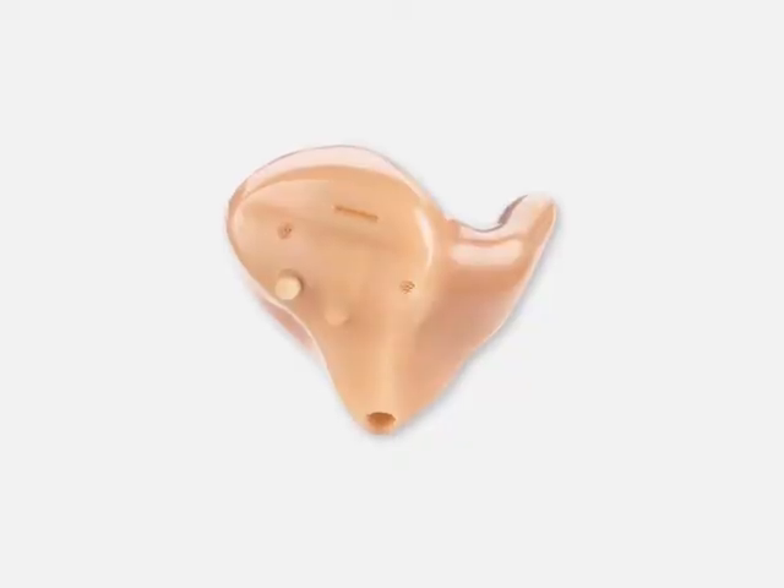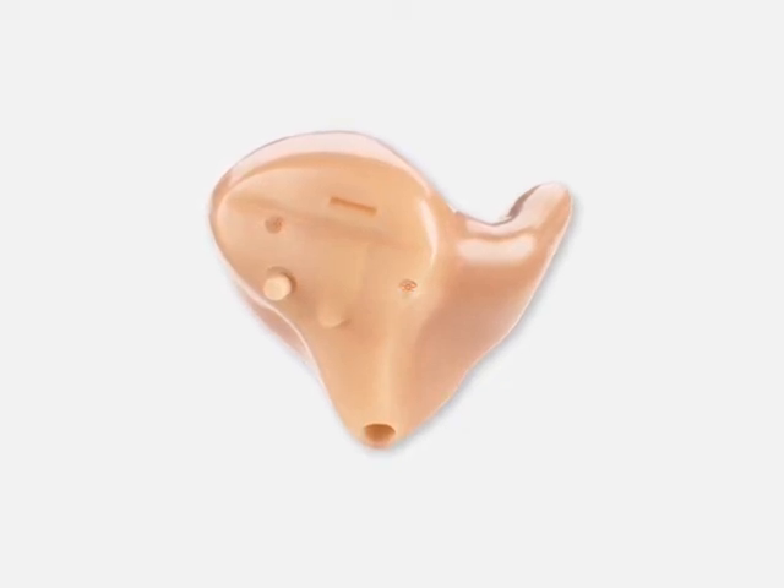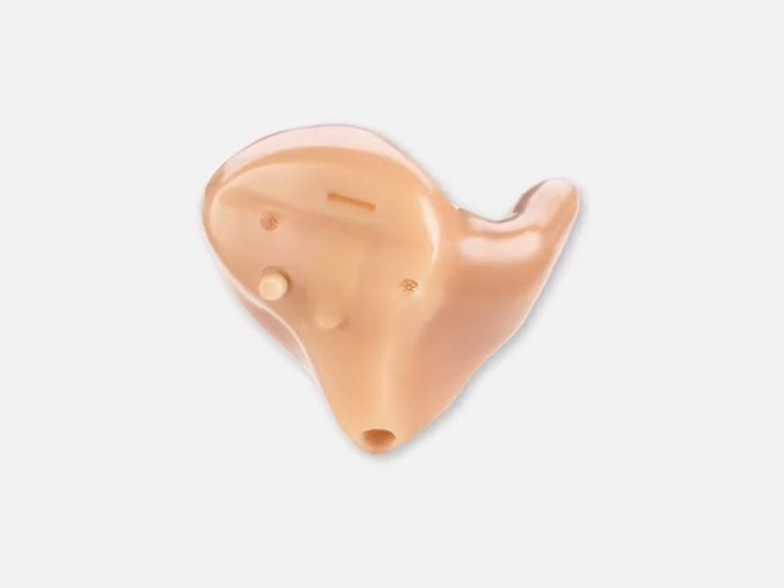We started with in-the-ear hearing aids. For many years, custom instruments were the hearing instruments of choice for our patients. They were small, cosmetically appealing, hassle-free, and easy to insert.